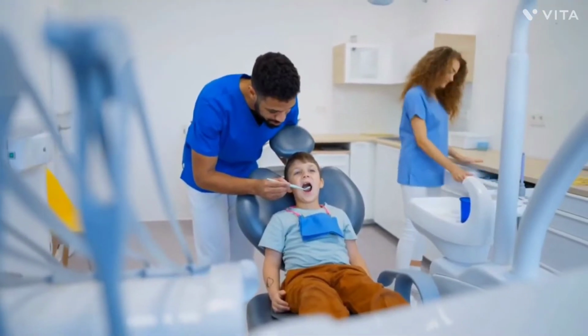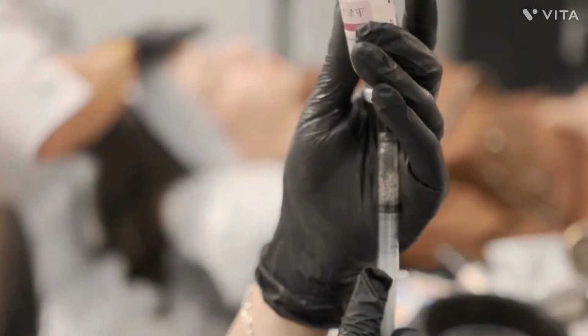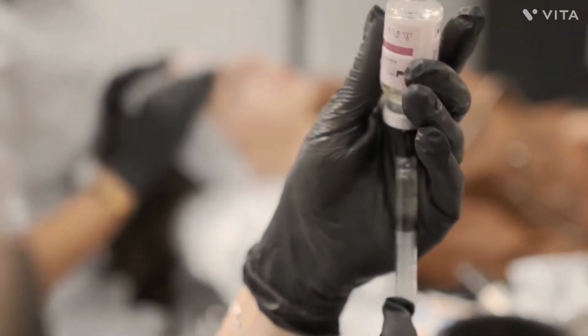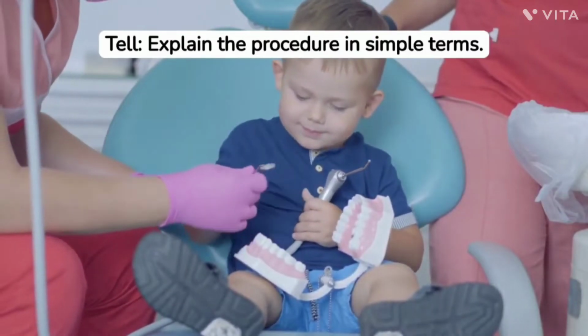Keep the instruments or the forceps behind the chair. Never show instruments to a child. And also never hold the needle in front of a child. Always keep the needle hidden by the fingers so that the child is not scared of the needle. Very important, apply the tell, show, do technique.